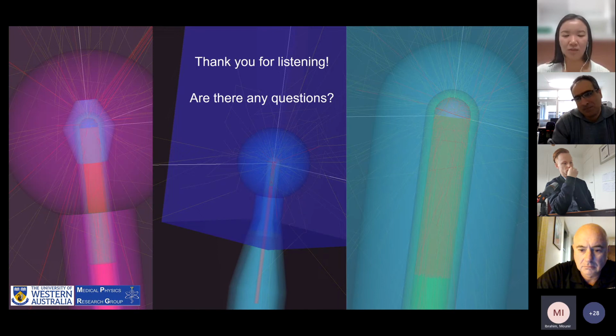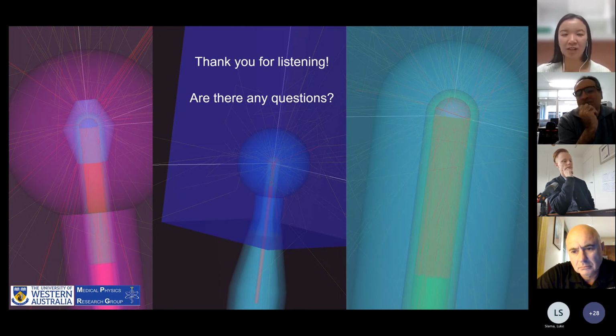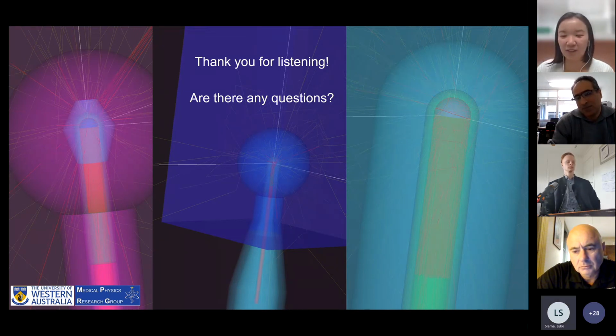Yeah, good. I just got a question as well. Very good work. When you said you did the film in the XY plane and then the ion chamber in the Z plane, did you validate the isotropy of the Intrabeam before you did that, or did you just assume that it was isotropic? No, we didn't really investigate the isotropy that much. That could be something for future work, to quantify the isotropy.